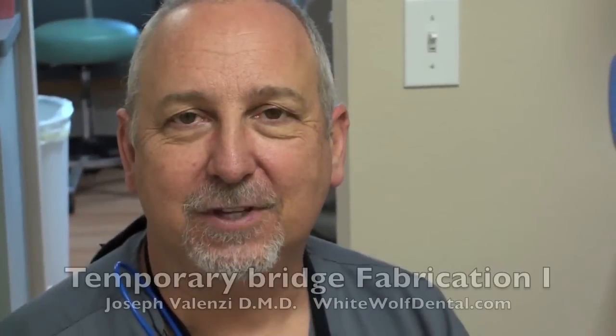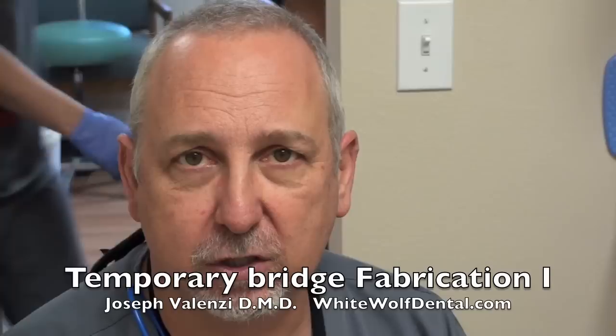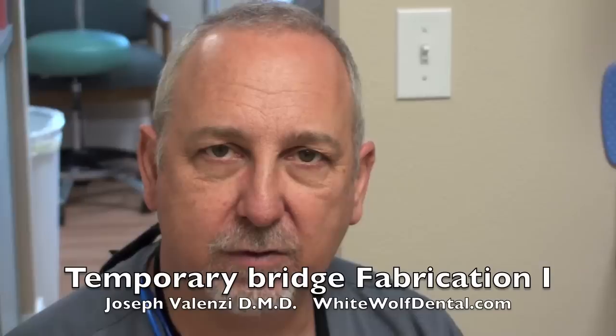Hey, this is Joe Valenzi here. We are filming today a little tutorial on how to make temporary crowns — temporary bridges actually. This is more complex than making single crowns because we've got multiple margins to worry about as well as embrasures.